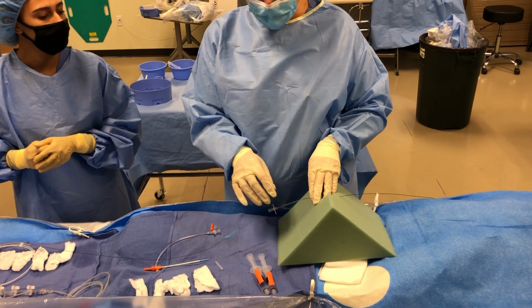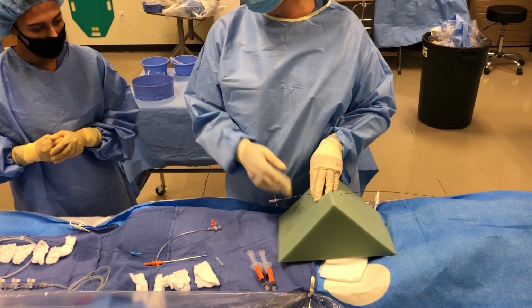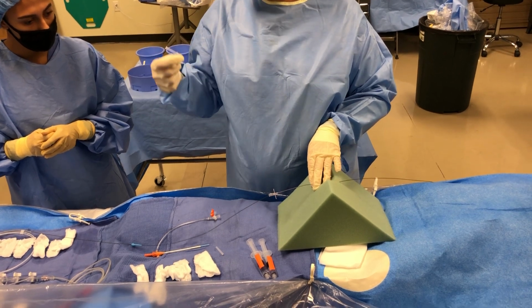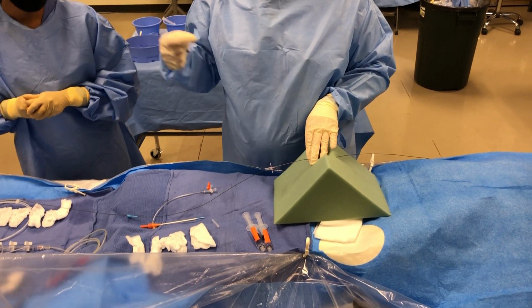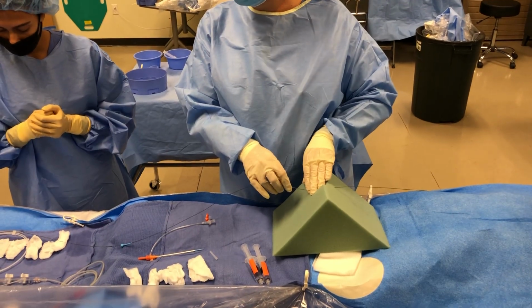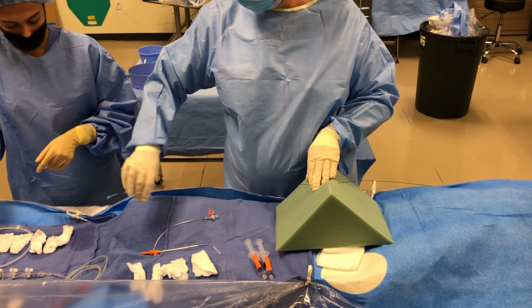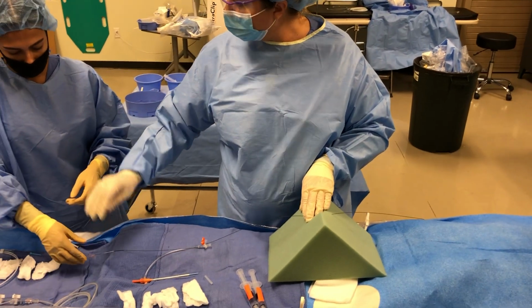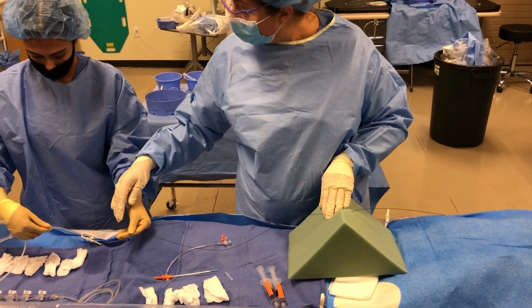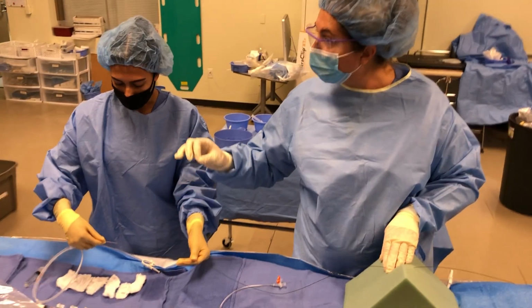Remove my needle, because the needle is a larger bore than the wire, and so there could be a little bleeding at the artery site, at the hole in the artery. That's called the arteriotomy. And so they probably will apply a little bit of pressure there. They're gonna pull the needle down here, and then this is where you're going to finish for them.